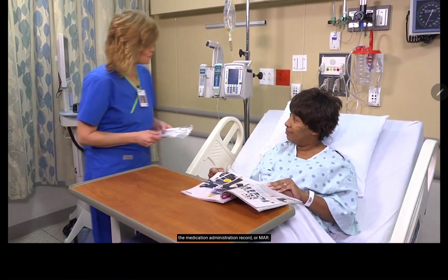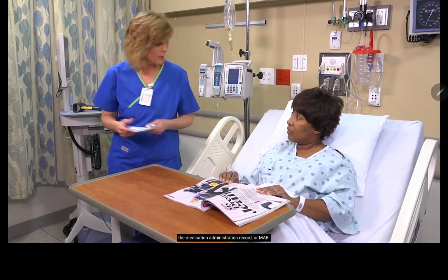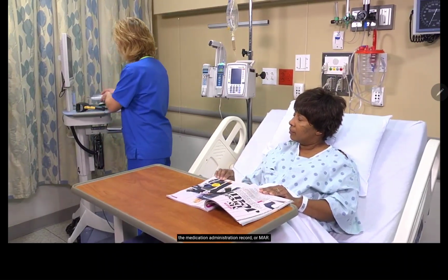Hello. I'm Jennifer. I'm going to be your nurse. I have an antibiotic now to hang for you. Okay. I'm just going to wash my hands and I'll be right back to do so.